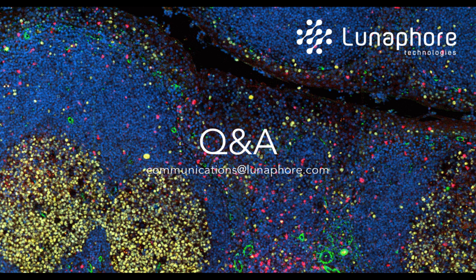It will give us an idea of how far we can go in the elution for each epitope and allow us to decide whether we have to localize each marker at the beginning, in the middle, or at the end of our eventual multiplexing experiment. So yes, for some epitopes the elution can harm the binding. However, we can manage it by characterizing the marker during optimization.